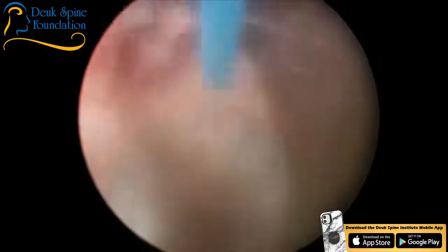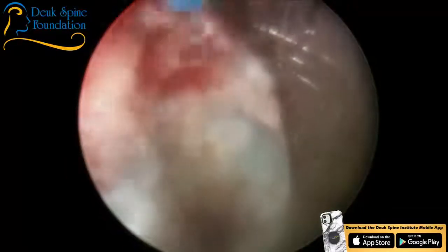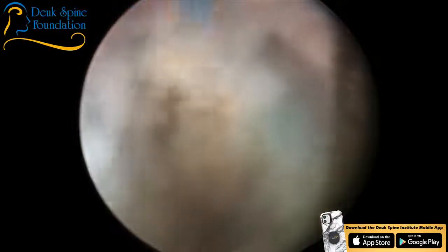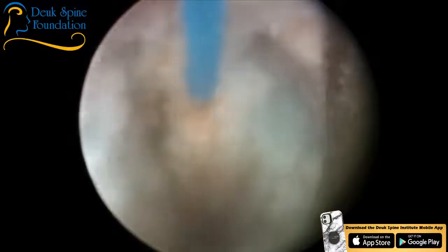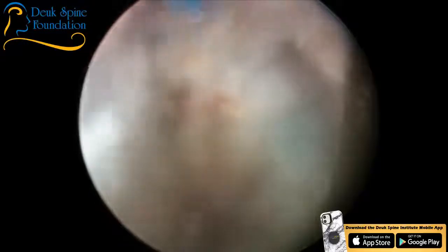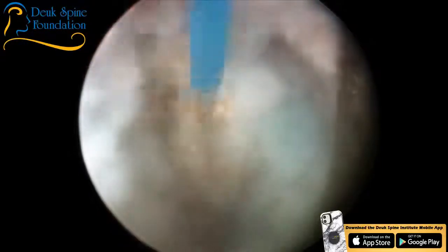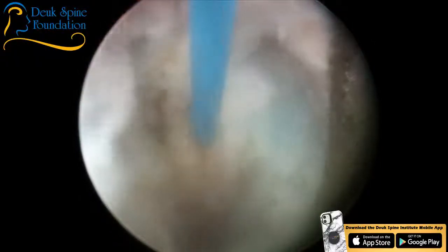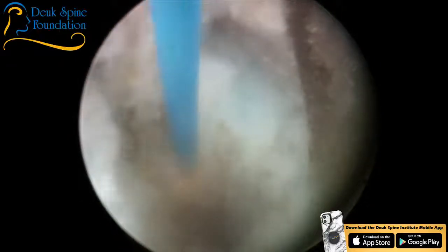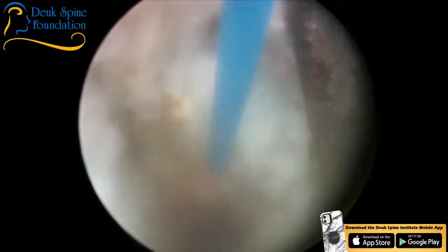Gosh, the scar tissue from, this is the annular tear, by the way, folks. I'm literally zapping away at it, just taking forever because so little of it comes out with each blast of the laser, because it's so thick and it's been here for so long. And I need to get rid of enough of it that it'll promote it to heal properly. I'm just about done with it.